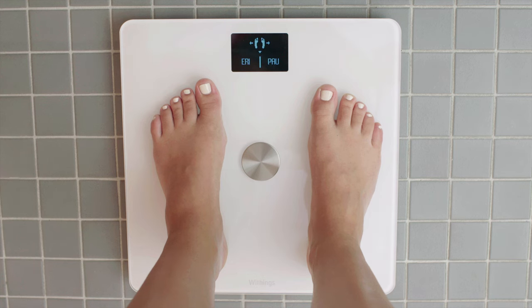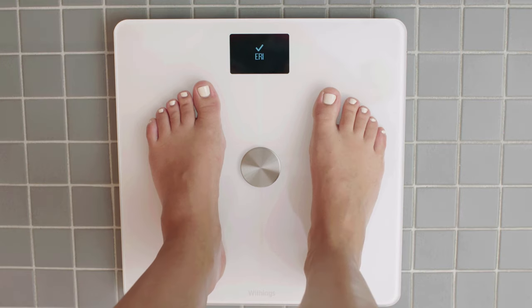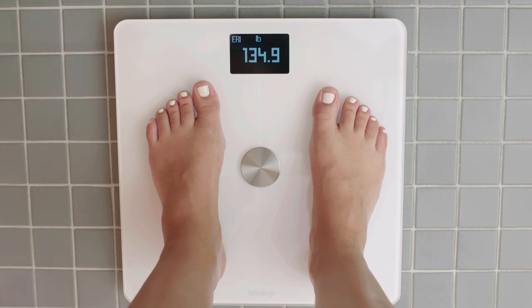You'll see your initials appear next to the user icon. If there's another user on your scale with a similar weight, you'll see their initials appear as well. Put more weight in the direction of your own initials to select yourself, then center your weight once again once the screen confirms your selection.